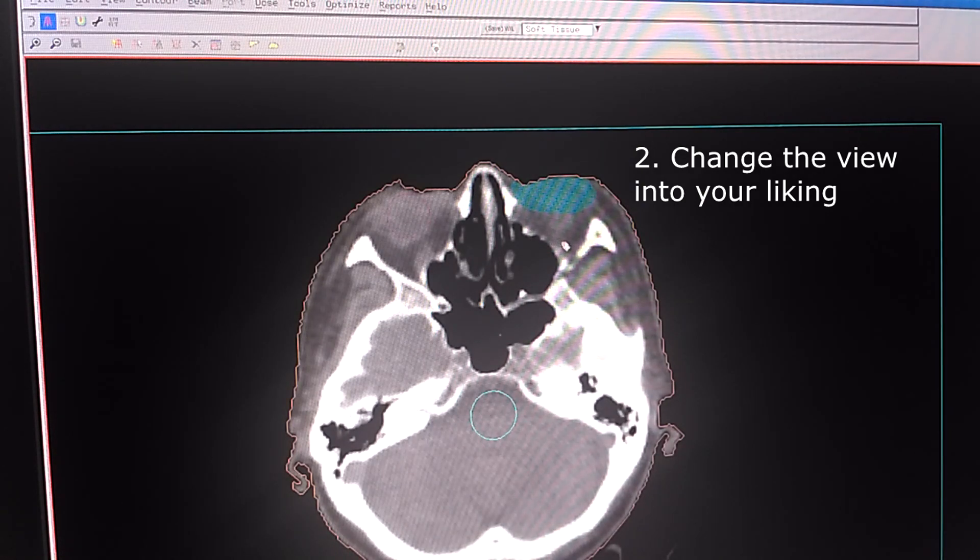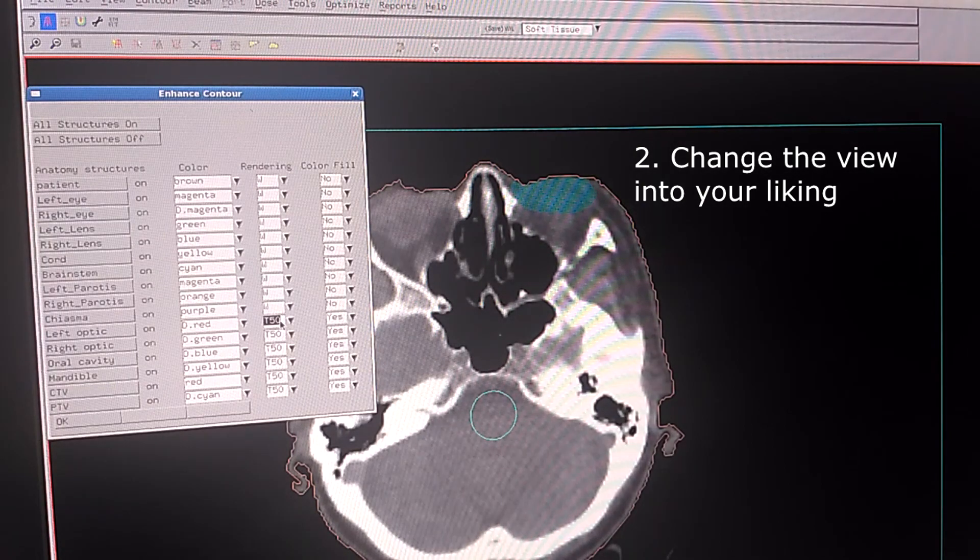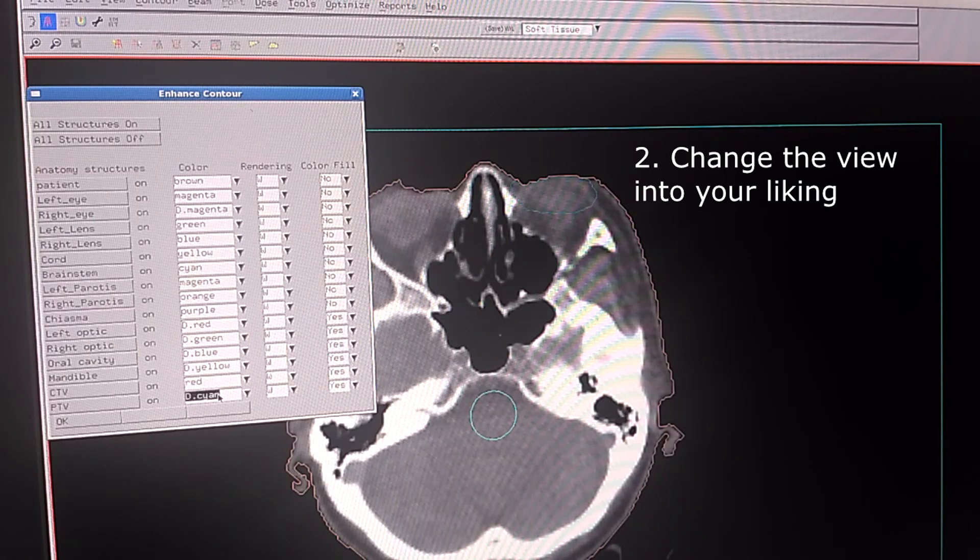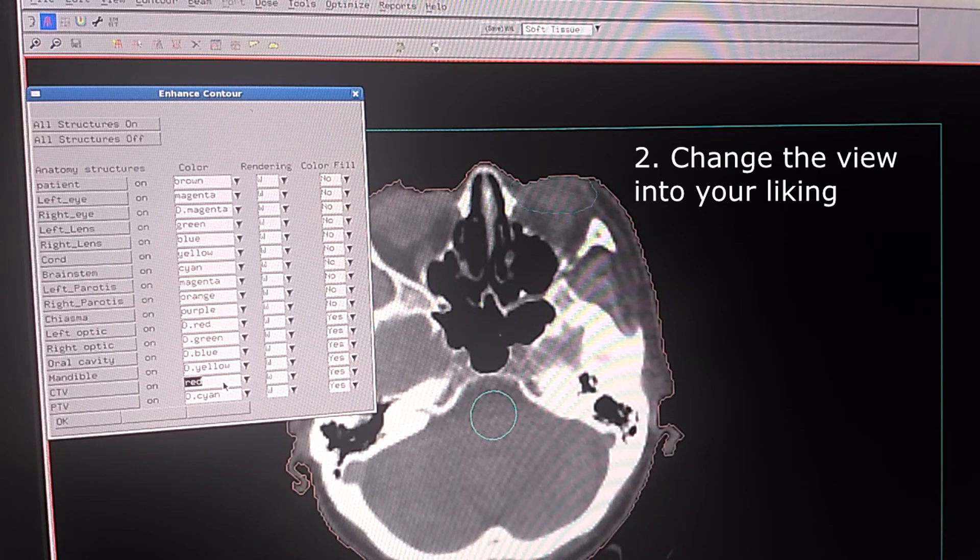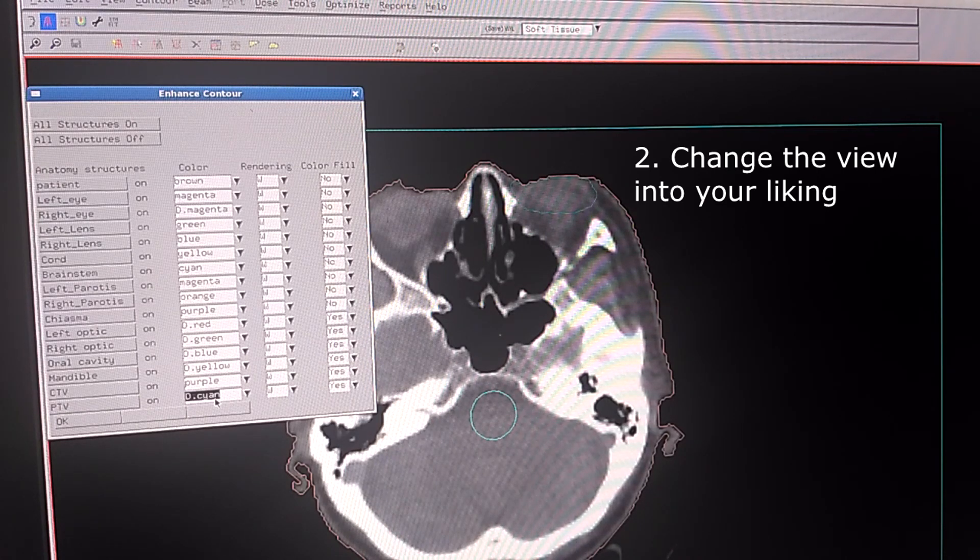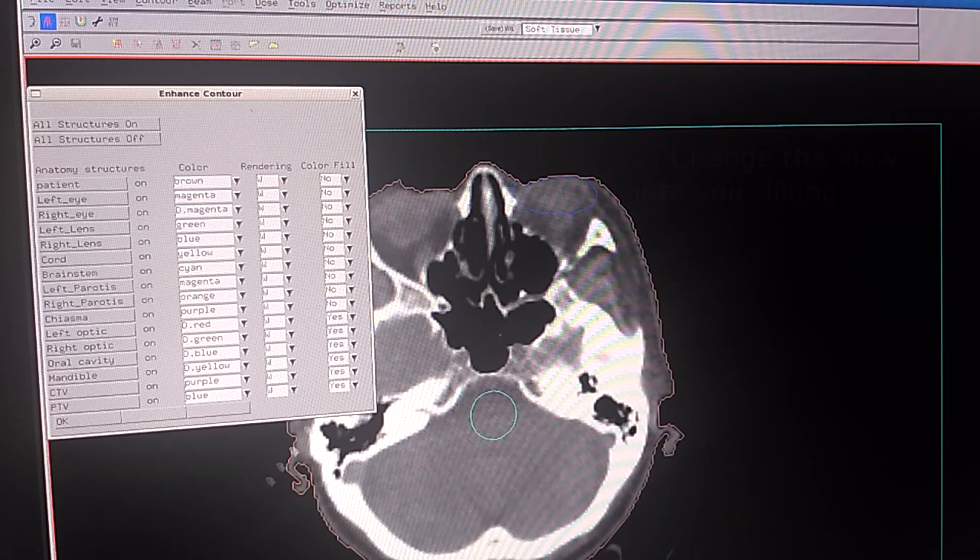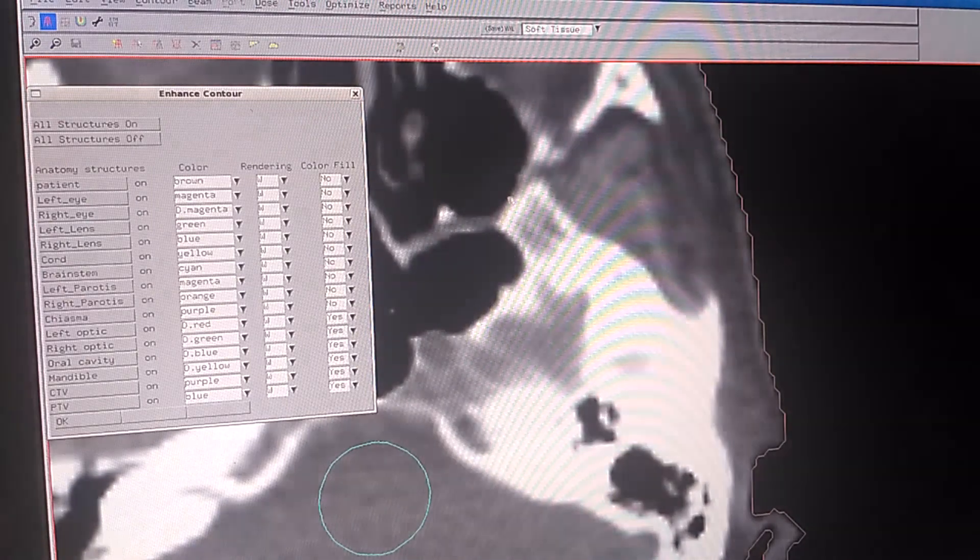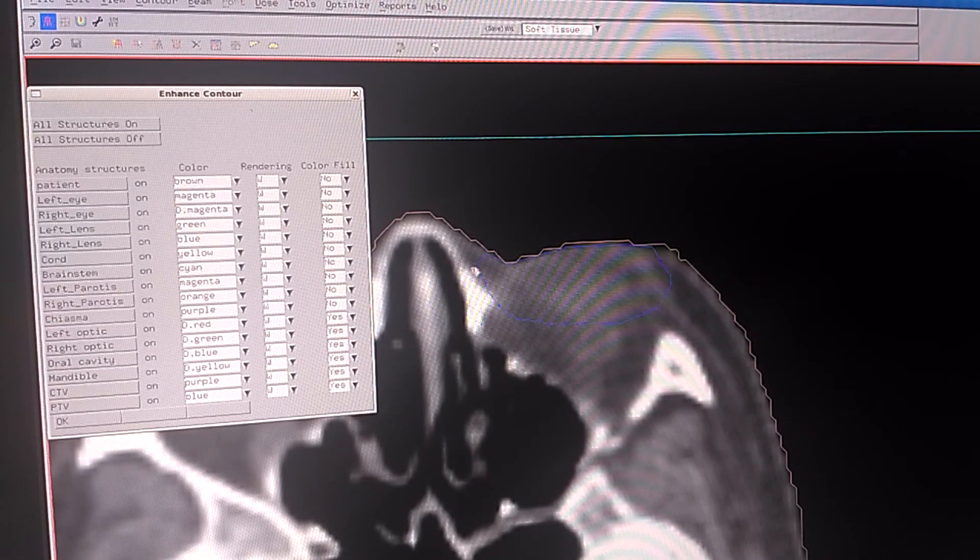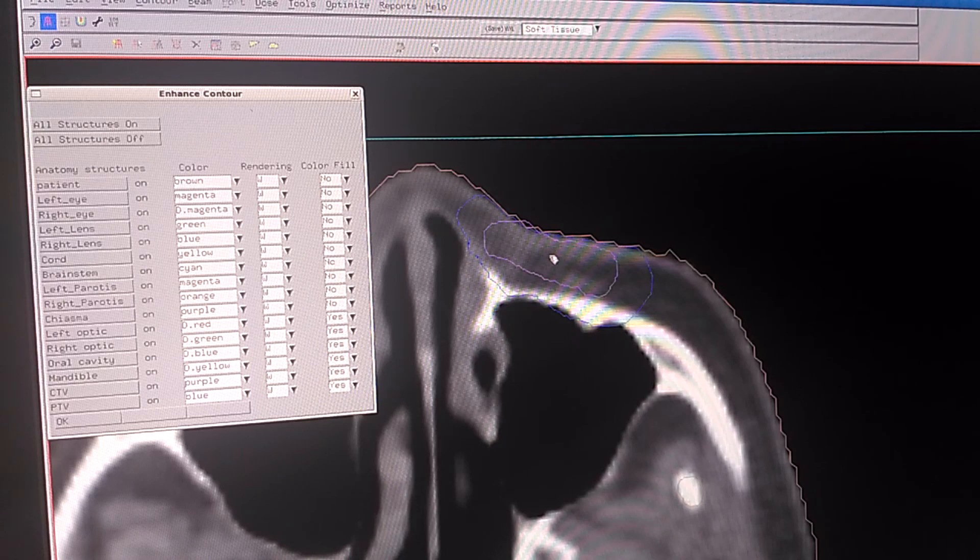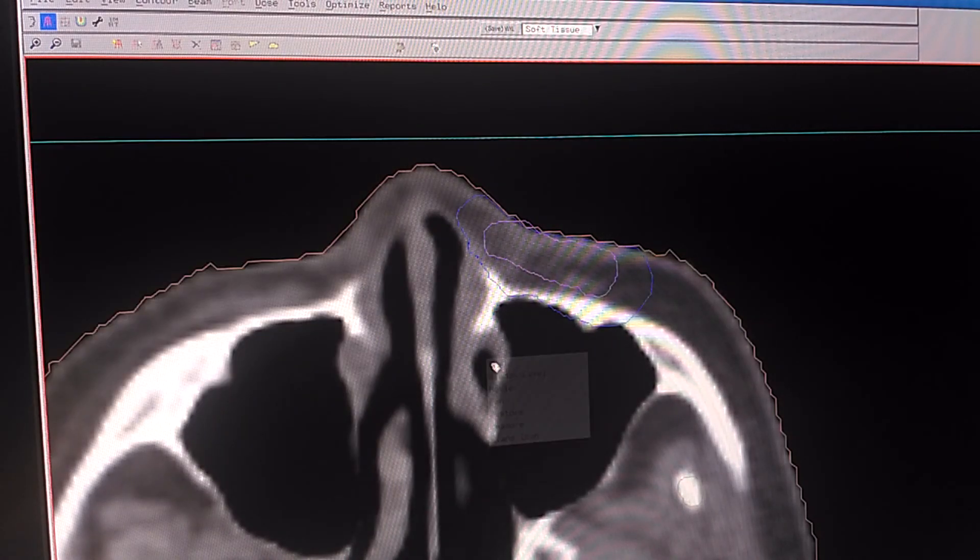I am also going to change the rendering of the structure into wire, so it will not overlap with the dose. I am going to change the CTV into purple and the PTV into blue. You can see it here, this is the PTV and this is the CTV. Click OK.